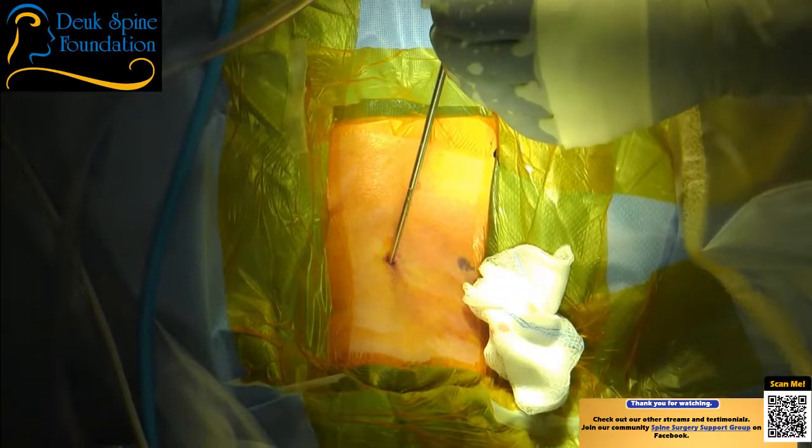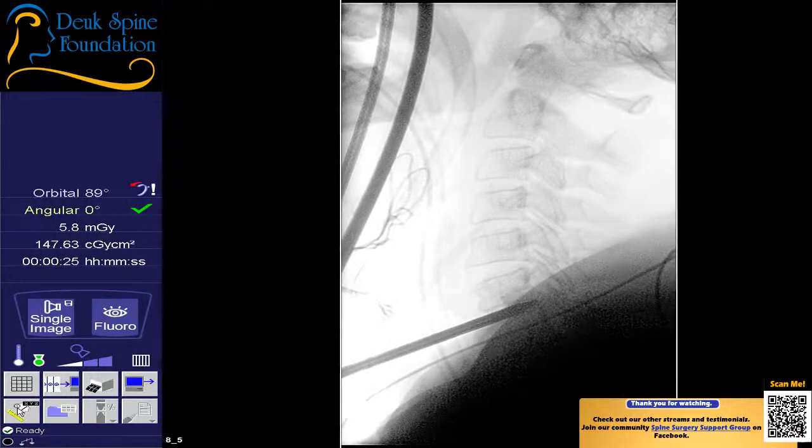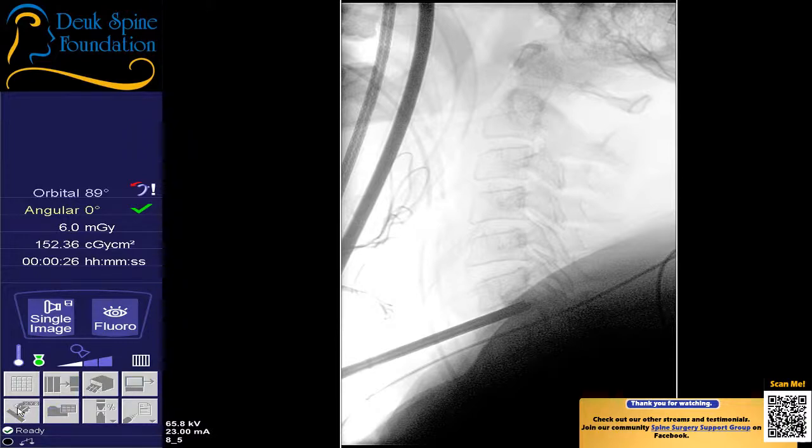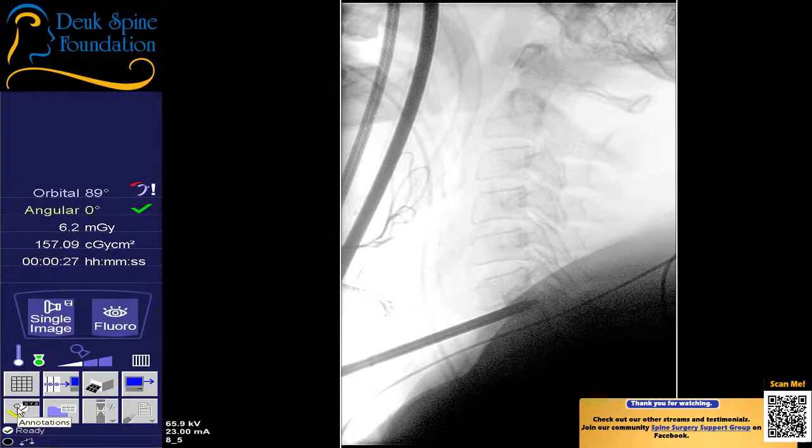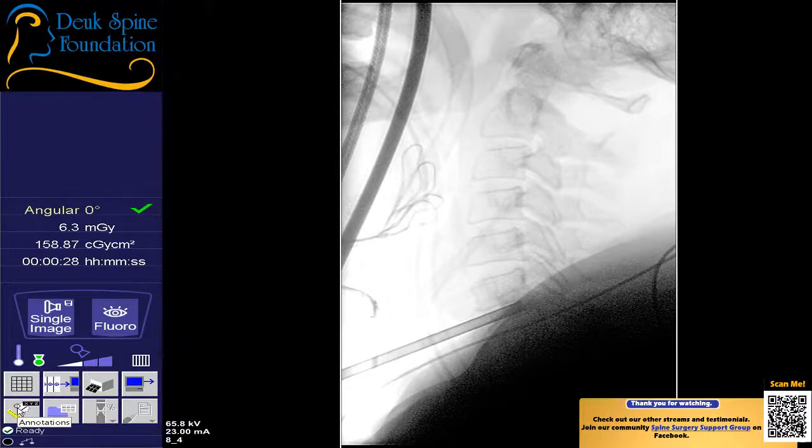And the goal here is to get the tube right at the base of the herniation, right at the beginning of the herniation. And then I'm going to use the laser and endoscope to take the herniation out. All right. That's pretty darn close. Let's see if I can get a little bit closer. That's about as good as I'm going to be able to get it right now without removing some of the herniation. So we're going to take the dilator out, and what we're left with is the actual tube.